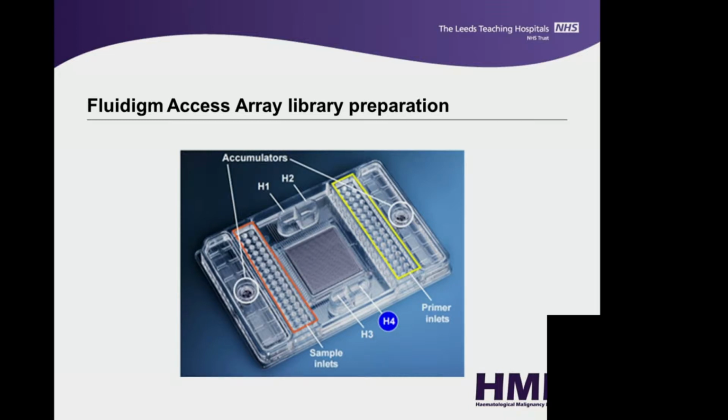And so what we have at the end of all of this, with pressure used to actually push samples and reagents across the array, are 2,500 individual PCR reaction vessels. And so our multiplex primers, we multiplex up to 10 primers per well from this side, and our samples, 48 samples. So we're running on a weekly basis 48 samples every single week, week in, week out.